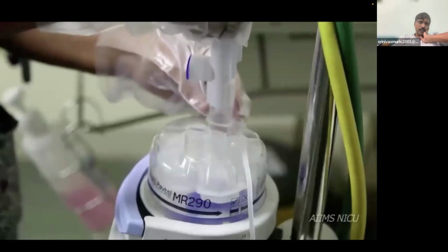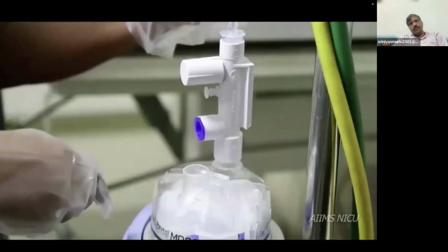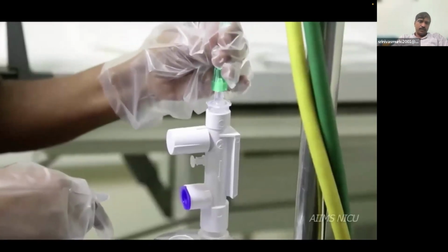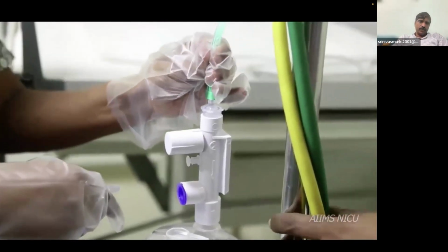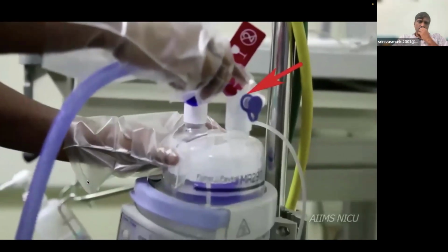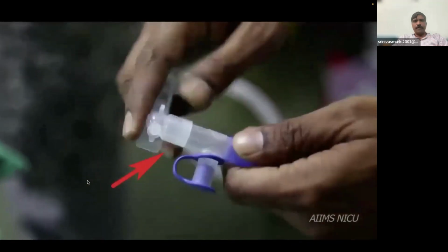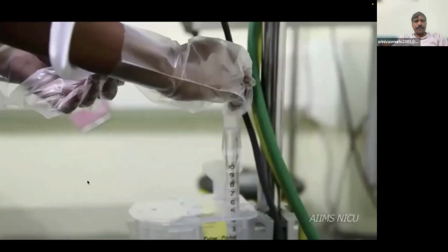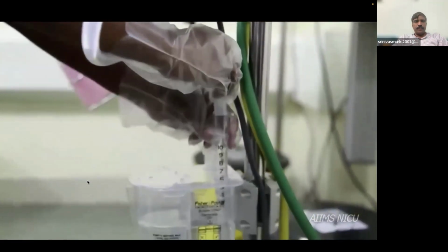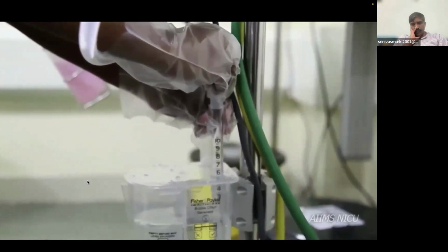stand. Now fit the safety device between the flow meter and the water chamber of humidifier using the green gas tubing. Now connect the blue inspiratory limb to the other port of the water chamber. To the other end of the blue inspiratory limb, lock the white expiratory limb of the bubble CPAP circuit. The second end of the expiratory limb is connected to the bubble chamber.